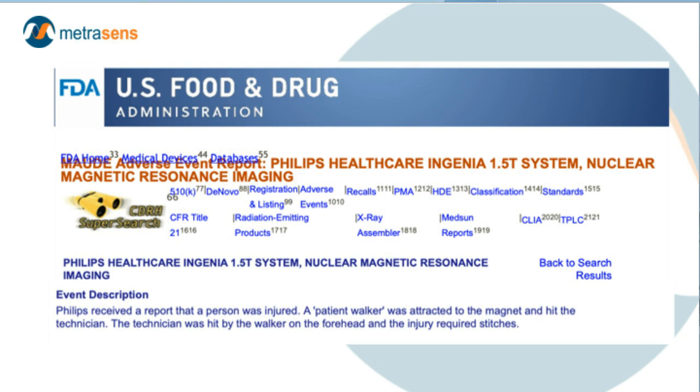A couple of the potential responses are, as a part of the design of the facility, we could anticipate additional equipment, whether it's wheelchairs or transport beds or gurneys, whether it's walkers or crutches or something that we know to be safe in the MR environment. It's a limited number of devices and support material that would go towards promoting safe operation in the environment.